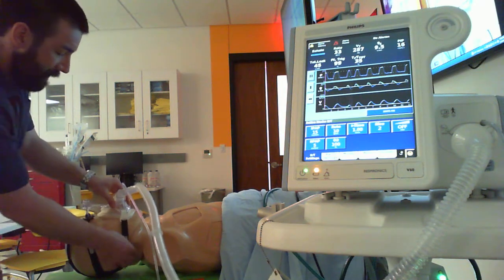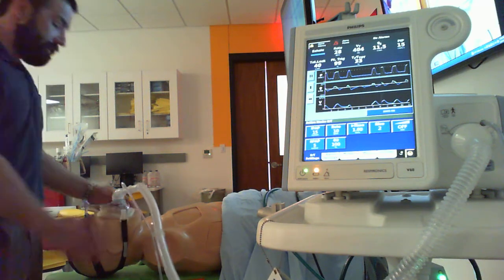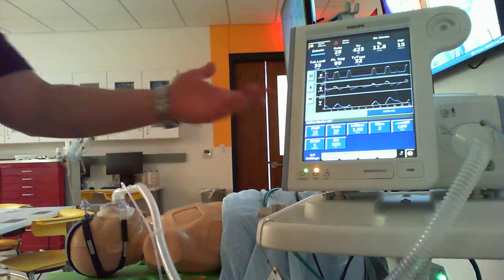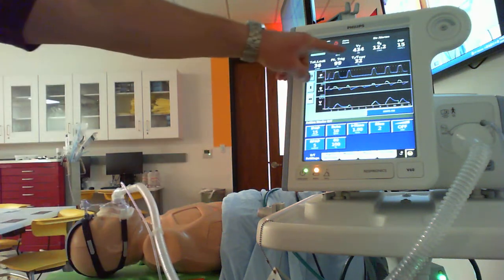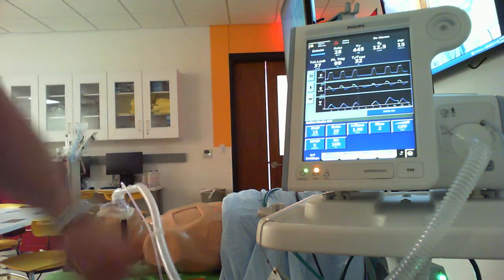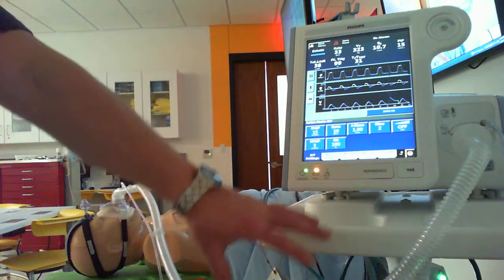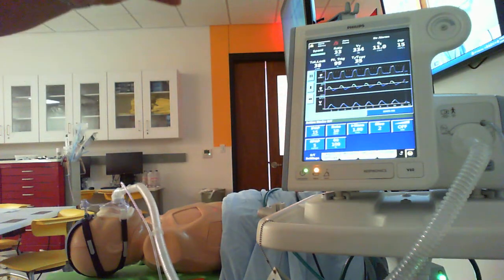Go back to where it is. I'm going to tighten these lower straps just a smidge. Okay, once again, that leak would be tolerable still, okay? But I like to try and be around that 30 liter. Okay, you can see for a second our tidal volume's got a little bit crazy. I'm going to give it a second, all right, while everything equilibrates. Once again, it's trying to assess that baseline leak. So I had a little bit of a big mask leak there.